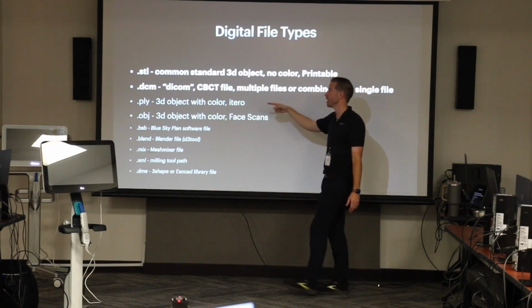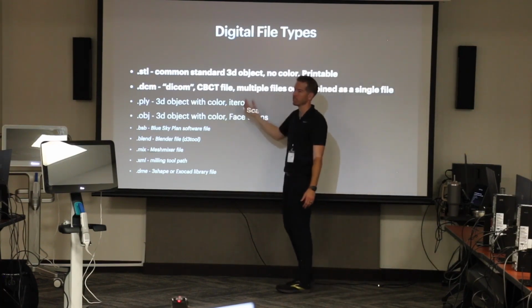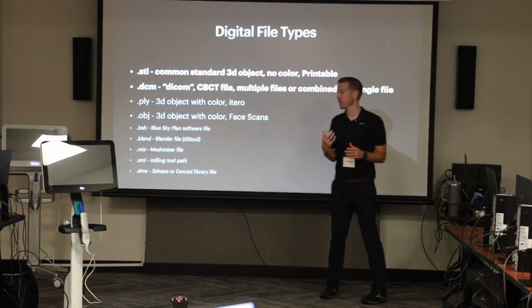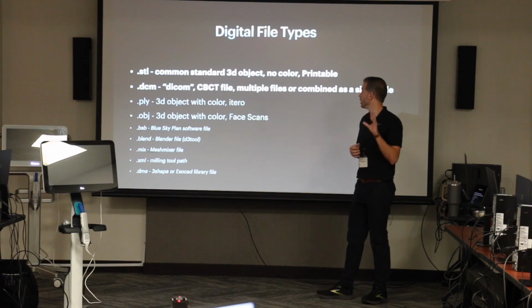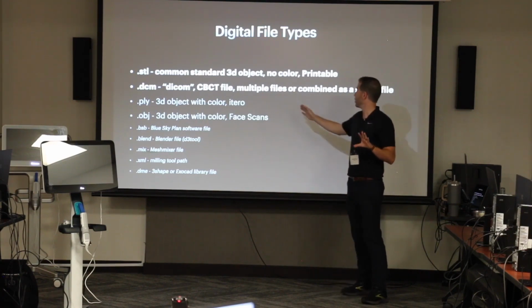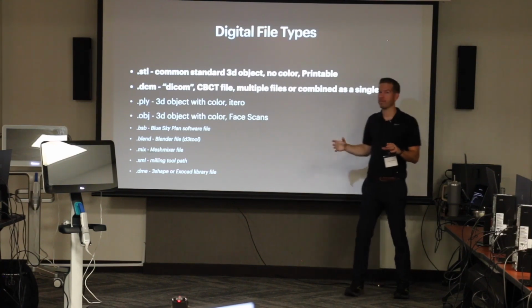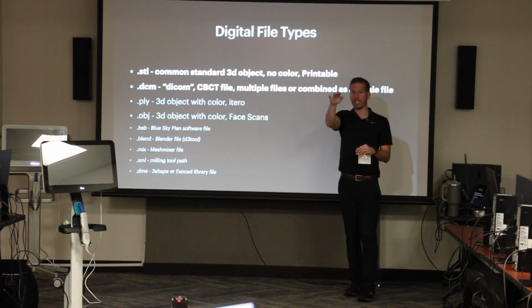And then .dcm, that's our DICOM. This is what our CBCT pushes out. So this is our bone, our structure. This is when we hear the term DICOM. It's a file that you guys may have seen if you try to export these things. Sometimes you get a folder with like a billion little files in it, and you're like, what is all these files? Which one do I use?